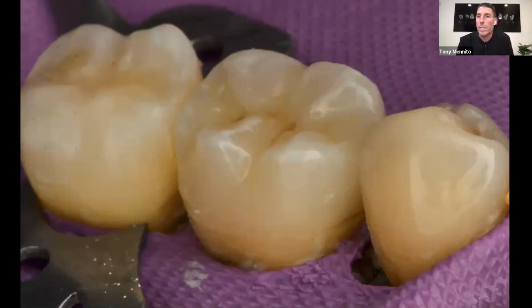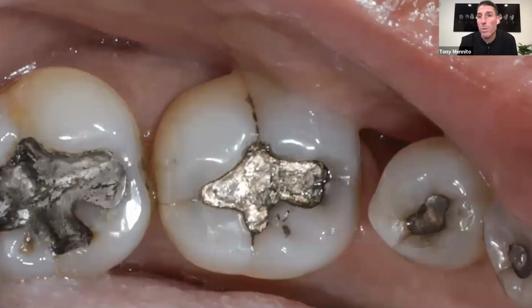Learning how to stain and glaze is a nice thing to be able to do, to train your assistants to be able to turn your crowns into something that looks like it belongs in the mouth.